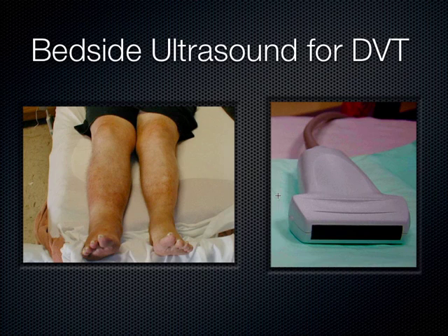You wouldn't want to use this probe on the aorta because you've got to get the sound to penetrate all the way down to the spine, basically, to see the aorta. So that's why I don't really like calling this the vascular probe, because it's got so many uses and you wouldn't want to use it on the biggest blood vessel. So I always call it the linear probe. But just so you know, you might hear someone call this the vascular probe. And it's the one with the highest frequency.